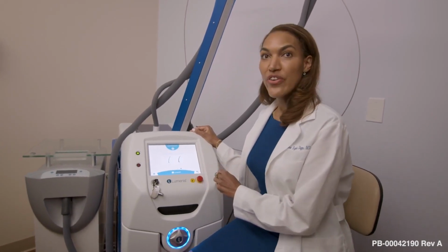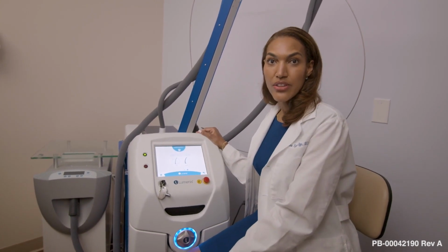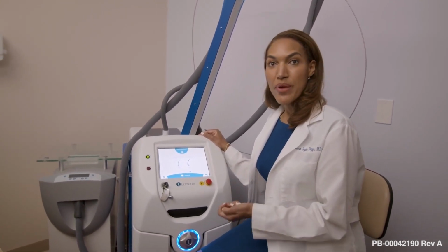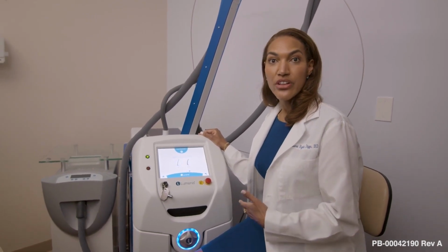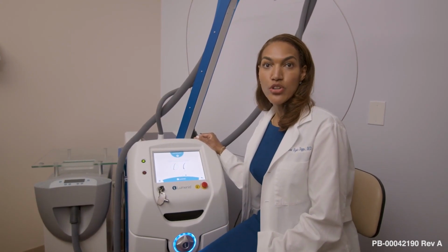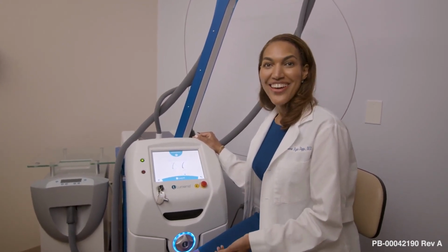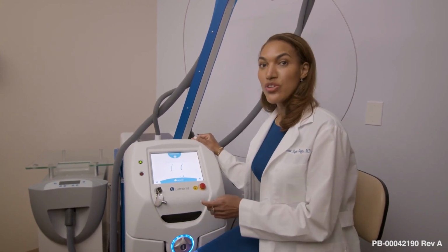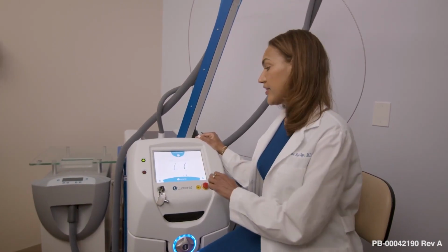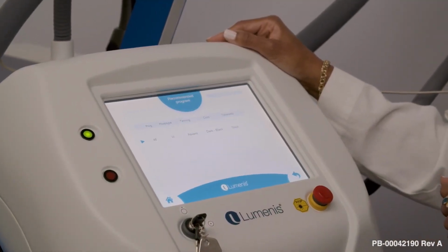And then it asks you thin or thick. So that depends obviously on the area that you're treating. So sometimes on the arm, you'll have thinner hair. Chin stubble may be thicker. Groin hair, genital hair might be thicker. But also, once you've treated someone multiple times, as the hair regrows, it regrows more thinly. So as you advance through your treatments, you will select a thin thickness of the hair. Today, we're selecting thick, because this will be our first time treating our patient.